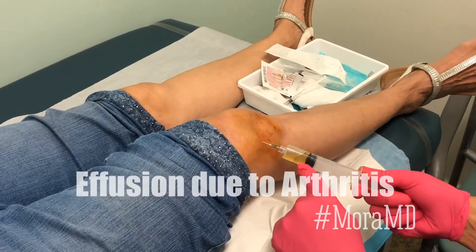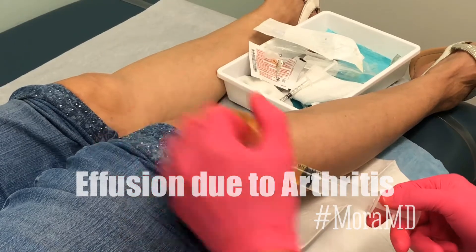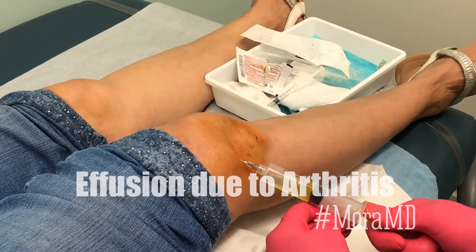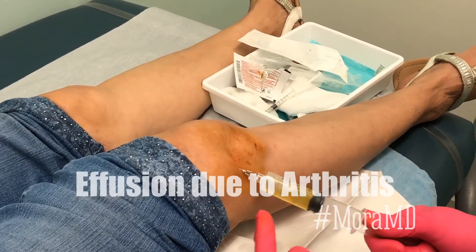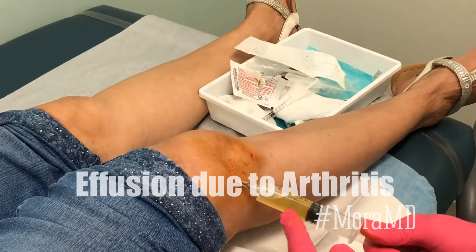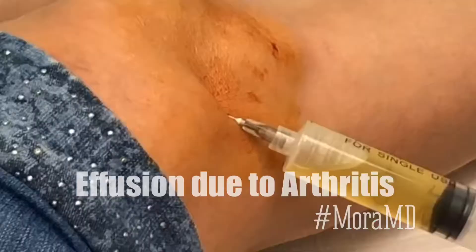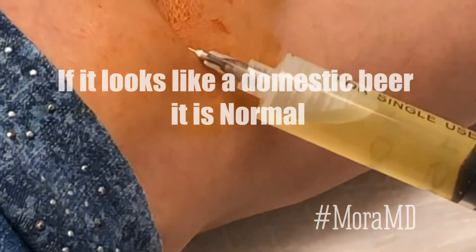It's yellowish or straw colored — very different from what we saw earlier, which was a hemoarthrosis. With a hemoarthrosis you have to use a bigger needle because it gets clotted up, but when you're doing a simple arthritic effusion a 22 gauge needle usually takes care of it, maybe even a little smaller.